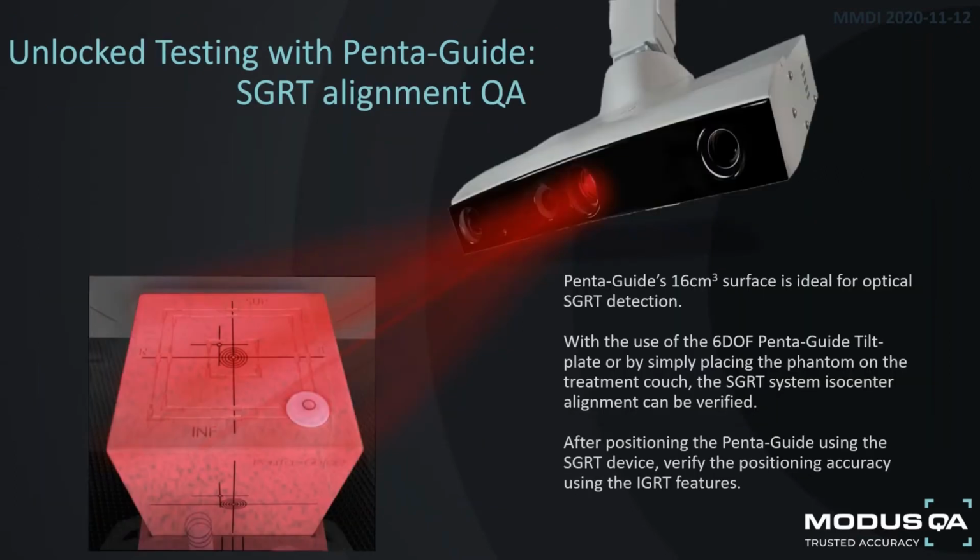Yeah, for sure. This may be news to some of you attending the session, but a very popular use of the Penta-Guide is verifying the alignment capabilities of surface-guided radiation therapy systems. So the Penta-Guide is supplied by some major SGRT equipment manufacturers as the preferred tool to QA their system. So the larger surface of the Phantom is easily detected by the SGRT optical system, and the included features provide the intuitive pass-fail determination. So in essence, the SGRT system will image the Penta-Guide Phantom and place it at the isocenter using the remote couch adjustments.